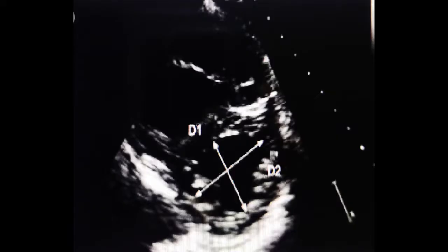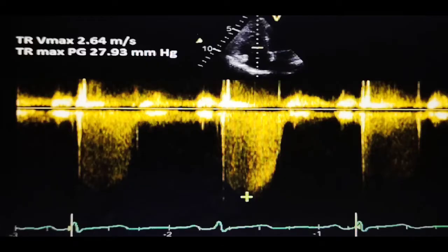Pulmonary arterial pressure can be estimated from the TR peak velocity. In this image, the TR maximum pressure gradient is 27 and TR Vmax is 2.64 m/s. If TR peak velocity is less than 2.8 m/s or not measurable, there is low probability of pulmonary hypertension. If it is 2.9 to 3.4 m/s, there is intermediate-to-high probability. If more than 3.4 m/s, there is very high probability of pulmonary arterial hypertension.